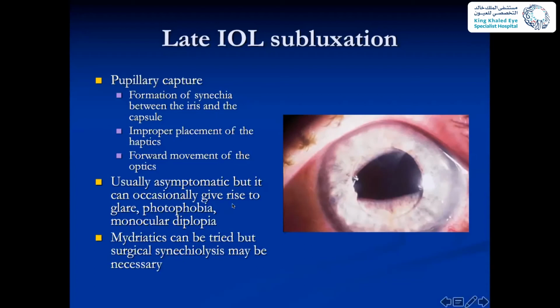Usually it is asymptomatic, but it can occasionally give rise to glare, photophobia, monocular diplopia, in which situation we have to intervene surgically to reposition this IOL. Mydriatics can be tried out, but surgical synechiolysis may be necessary to get this lens back in place.